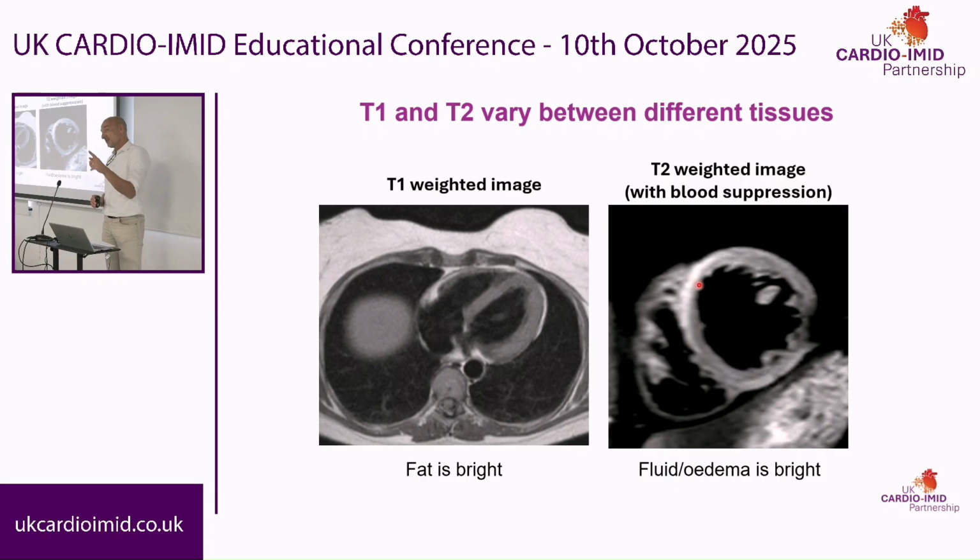So the observant of you may ask a question. They will say, well, hang on a second, T2 weighted imaging is sensitive to fluid. Which bit of the right-hand image is not bright that should be bright? What about this bit here? Shouldn't there be lots of water in there? Well, we use an additional trick, and right over there we have tricks to get rid of the signal in the blood, so we take that out. But you would have been right if you said, well, that should be bright because it's fluid. So well done for those who observed, but it wasn't many.